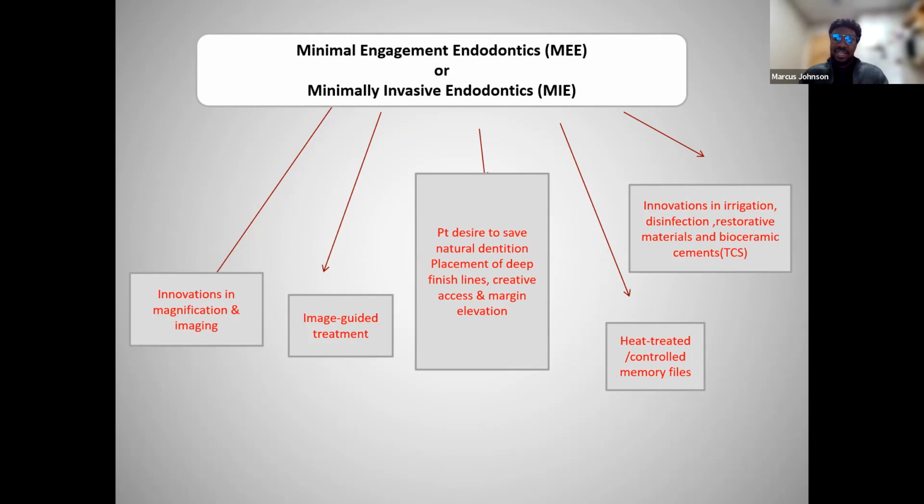And when we talk about radiation safety and exposure, I just completed a podcast, I guess a couple weeks ago. And I was engaged in a conversation regarding radiation safety. And when we really look at the studies, there are no studies that show organ damage or any tissue damage below 100 millisieverts. And when we think about cone beam CBCT, understand that cone beam CBCT at most is 30, 50 microsieverts. So we're saying that the literature does not support any major risk below 100 millisieverts, and it takes 1,000 microsieverts to equal 1 millisievert.